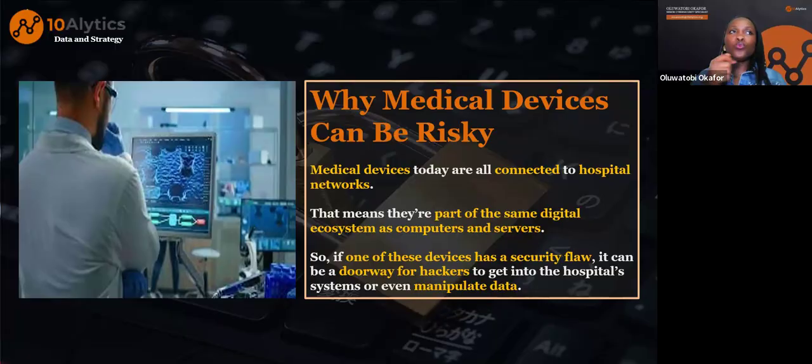But the issue is that with this kind of ease also comes a lot of risks, right? This is why a lot of these devices have become problematic to the areas they are found within, right? And because they are part of this same system of computers and servers, it means that if at some point maybe their printer has a security flaw, it was not updated, they didn't change the default login details that came with it, it becomes an entry point for hackers to get into the hospital systems, like Oluwaseun has said in a description of cybersecurity, right?